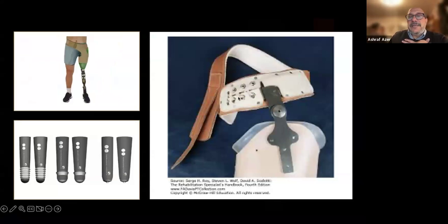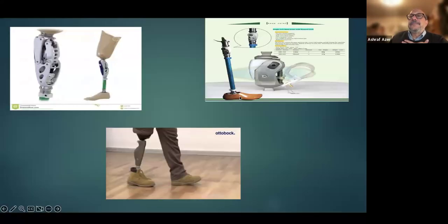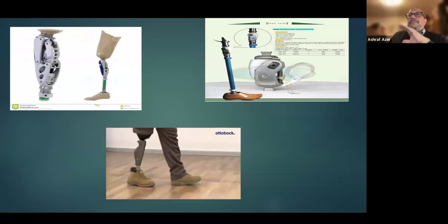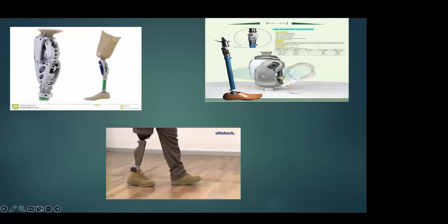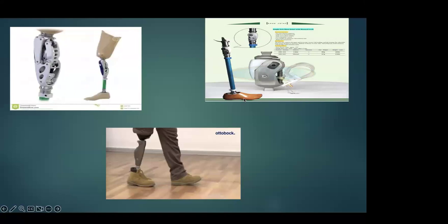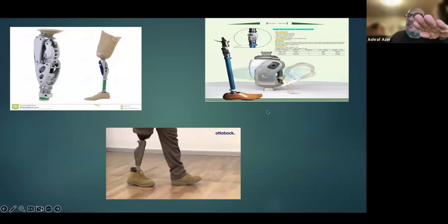Now, how, yeah, go ahead. There are types like the single axis and the free knees. Look, single axis, weight bearing activated, 4-bar knees, geometrical, all free. All of this is free. But there is single axis fixed. When you find a cable attached to the bone here, to the socket, okay? Yeah? If you see a cable, it's a fixed knee. Okay?